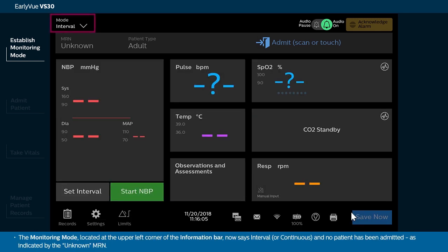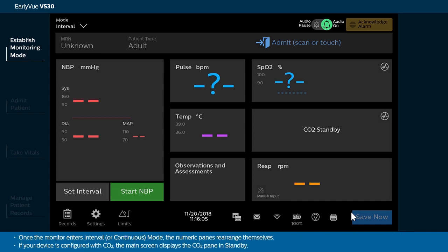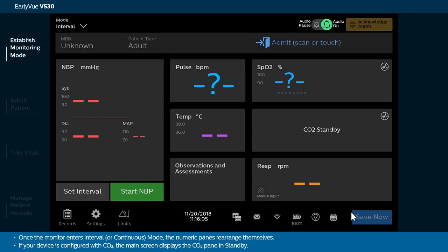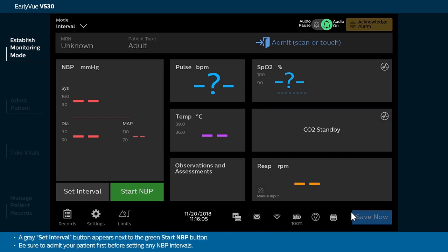The Monitoring mode located at the upper left corner of the Information bar now says Interval or Continuous, and no patient has been admitted as indicated by the Unknown MRN. Once the monitor enters Interval or Continuous mode, the numeric panes rearrange themselves. If your device is configured with CO2, the main screen displays the CO2 pane in standby. A gray Set Interval button appears next to the green Start NBP button.